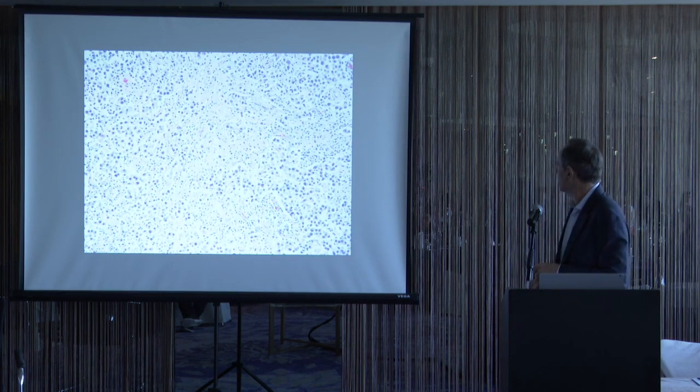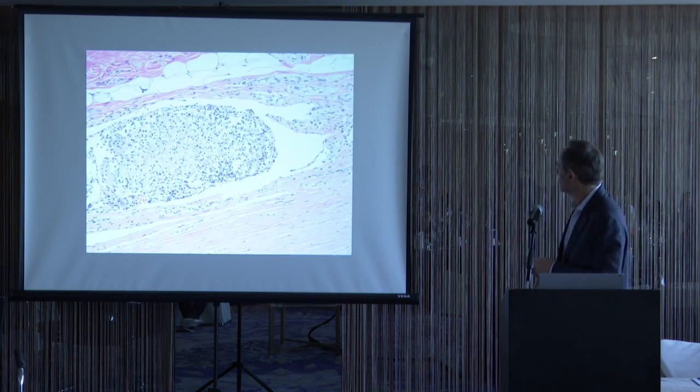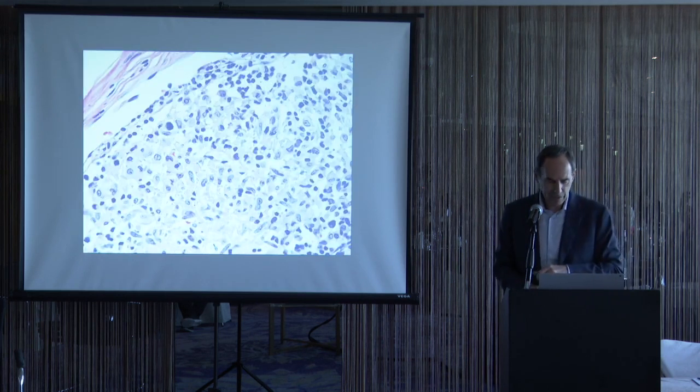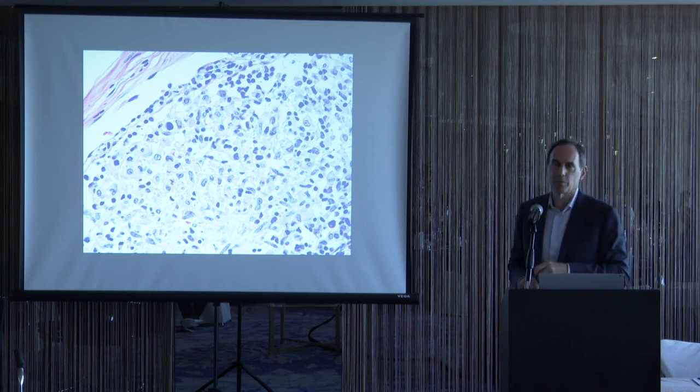Here's the invasive seminoma component. Here we see in a vessel that we have a histiocytic reaction. So there's some reaction here within these vessels, and then you want to look carefully to see what's in that vessel. And when you look closer within all those histiocytes, there are these hyperchromatic pyknotic seminoma cells that I talked about before.